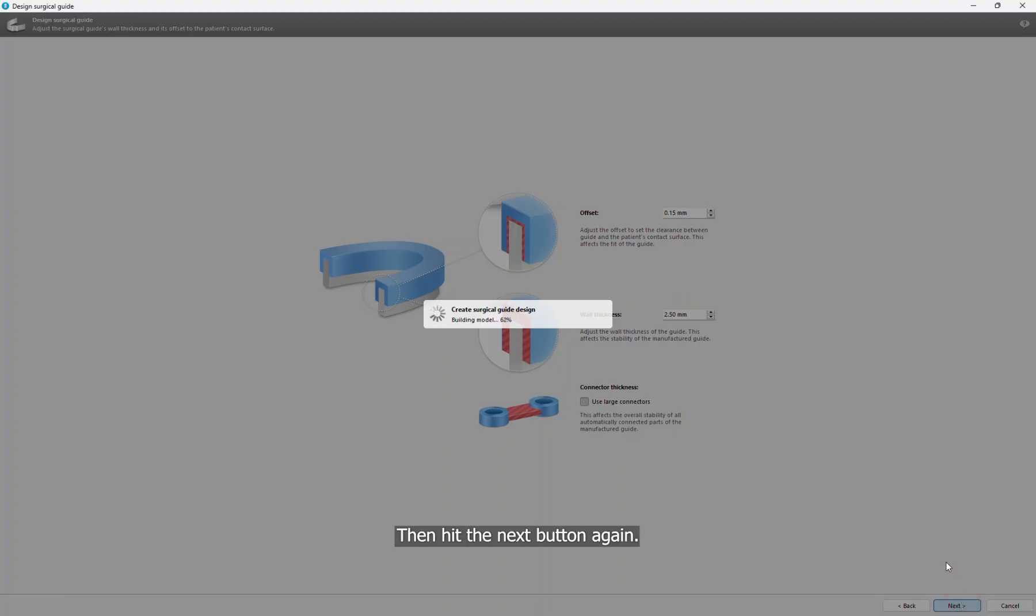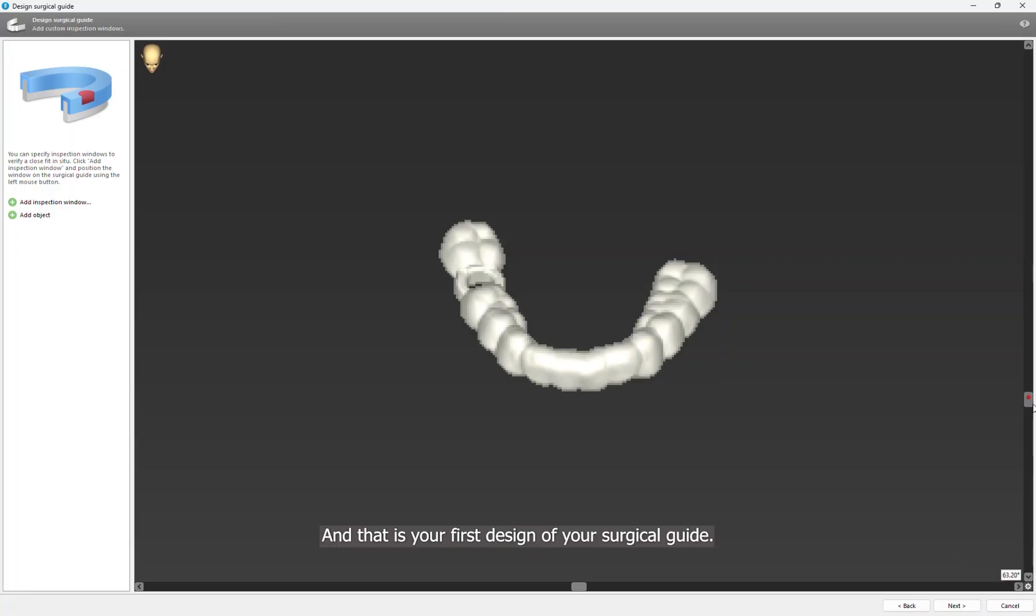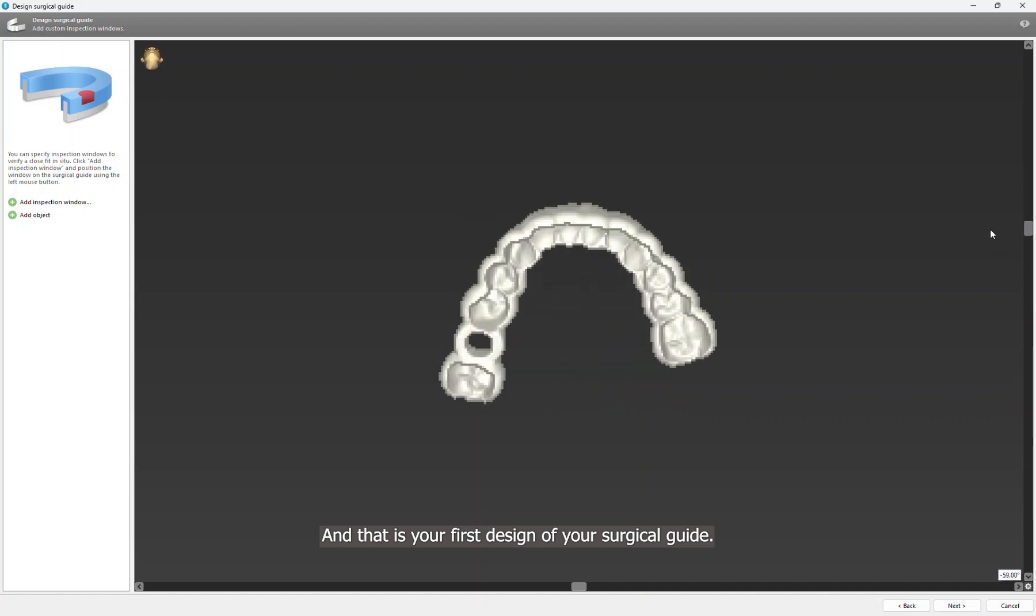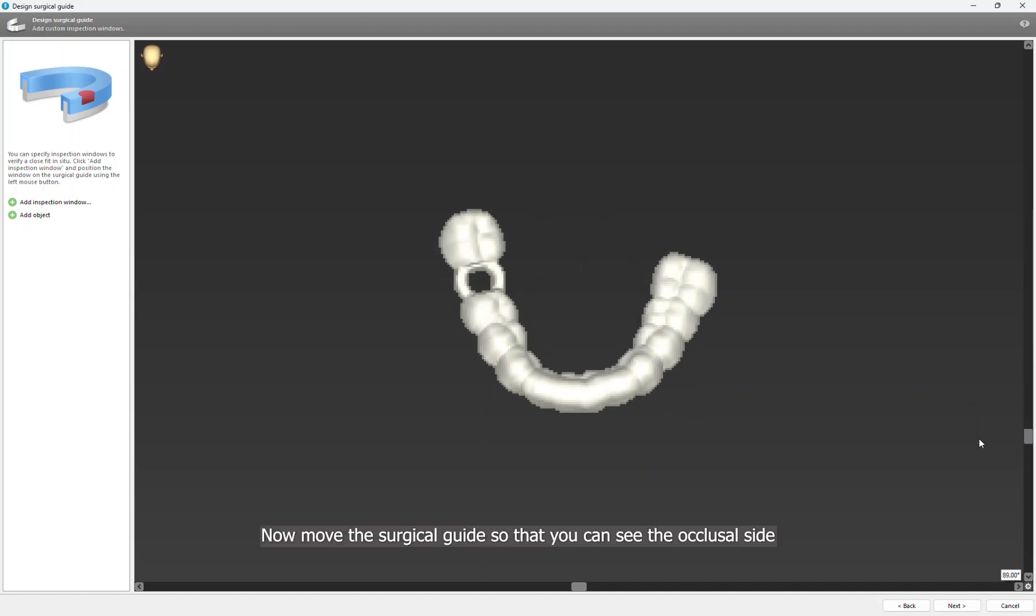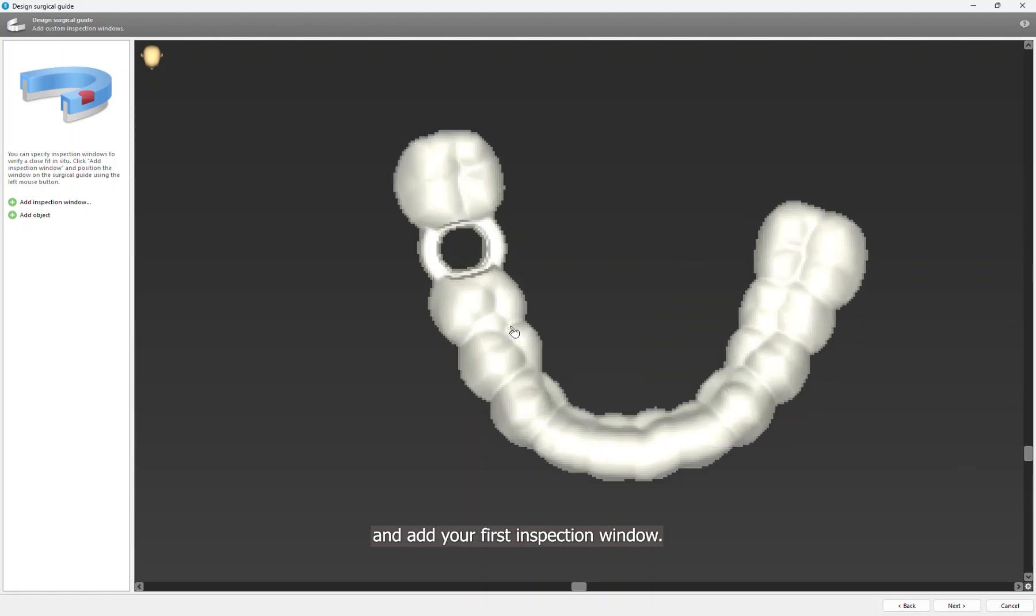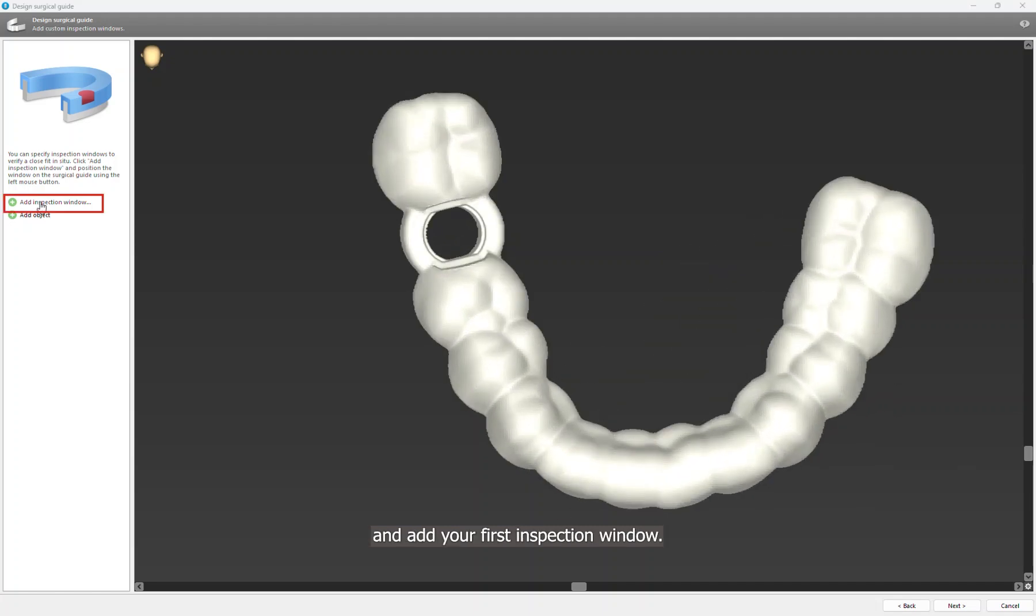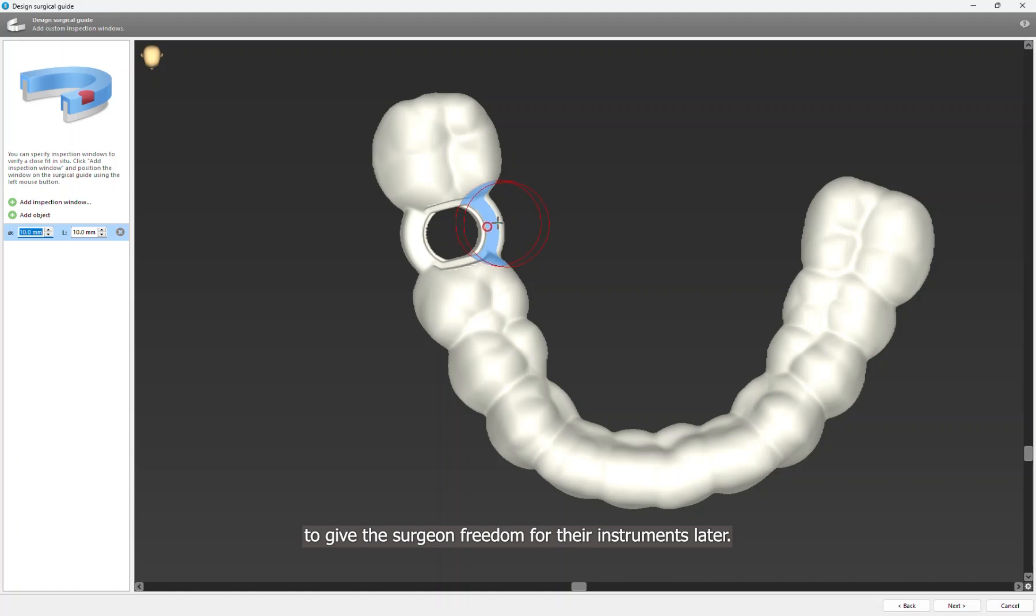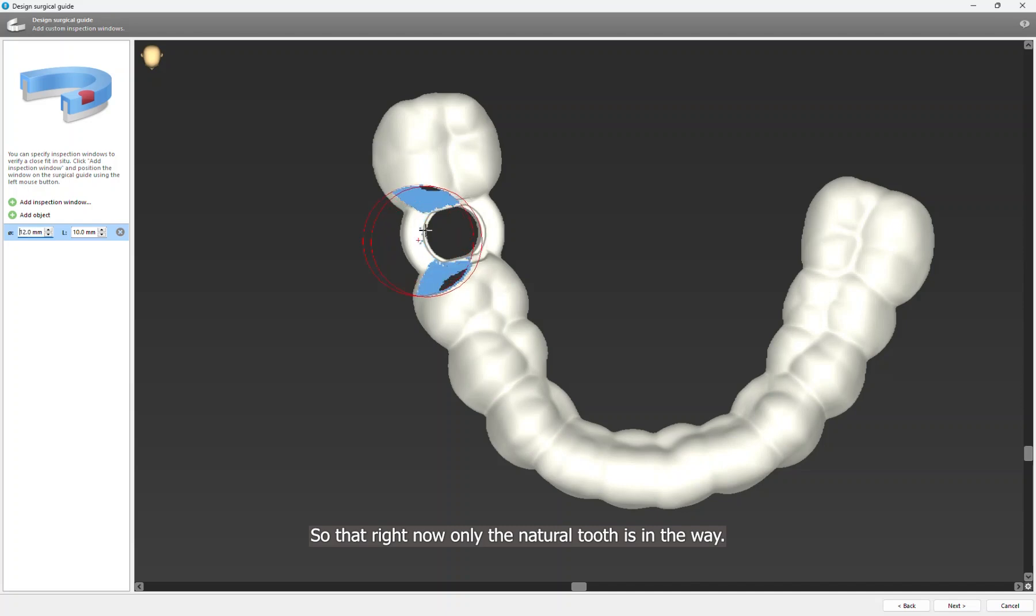Then hit the Next button again, and that is your first design of your surgical guide. Now move the surgical guide so that you can see the occlusal side and add your first inspection window. Now place it here on the ring of the sleeve holder to give the surgeon freedom for their instruments later, so that right now only the natural tooth is in the way.